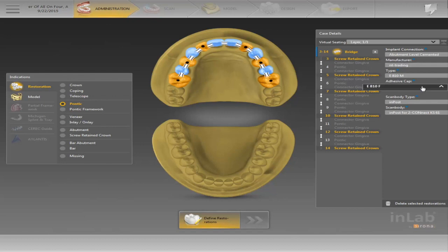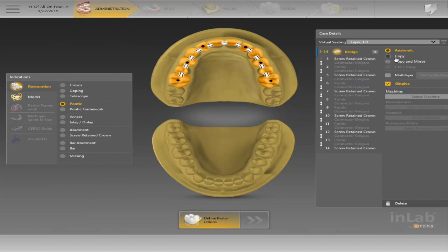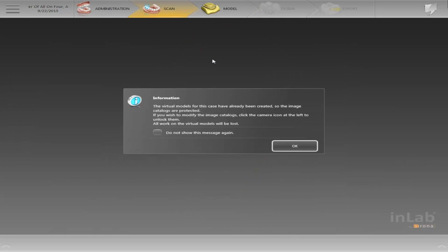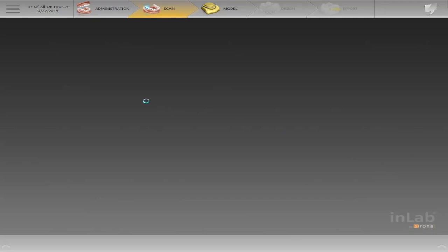This is the cap that comes with it — it's a multi-unit ImPost, and we get that from Henry Schein. There's only one scan body you need when it comes to InLab — you only have to buy one of them and it scans multiple. I'll show you that in the scanning section. It's already pre-scanned here. For this one I'm going to use the MCX5 high-performance polymers, and then we'll go to the scanning section so you can see all the different catalogs I've already scanned in.